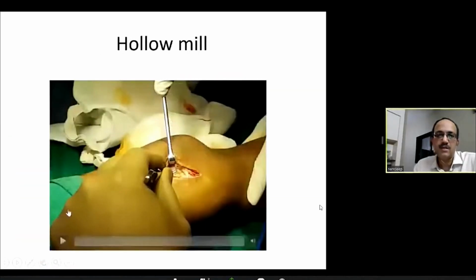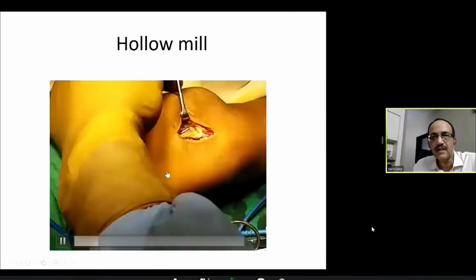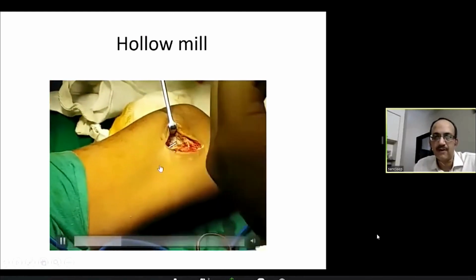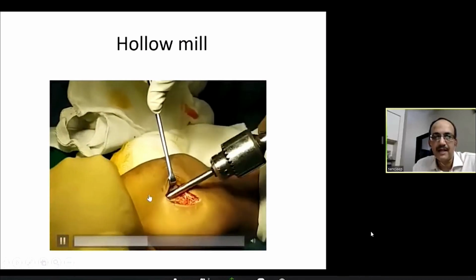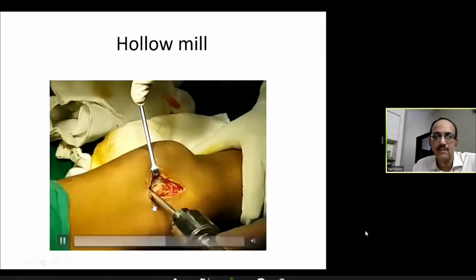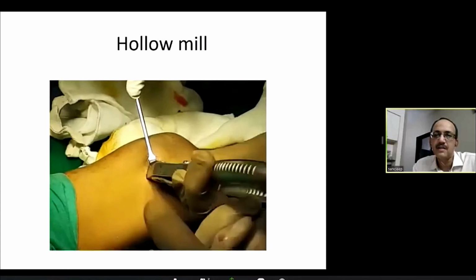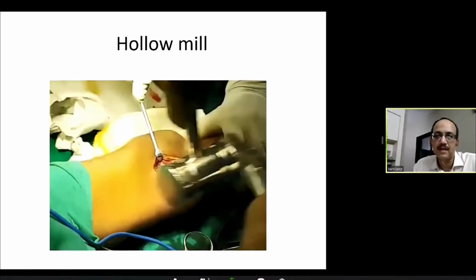Yeah. So this is a small video which I wanted you to see. Everybody in their hospital will have a hollow mill, right? So I'll just show you what I do with the hollow mill. You can see the nail tip here. This is a femur nail that I am removing. That's the nail tip flush with the cortex. So just insert a hollow mill, bend the nail 90 degrees. Once you bend the nail, your plier can grip it very well. And then you can backhammer it. Because it's a small area there and it's very difficult to hold a nail. It becomes so easy.